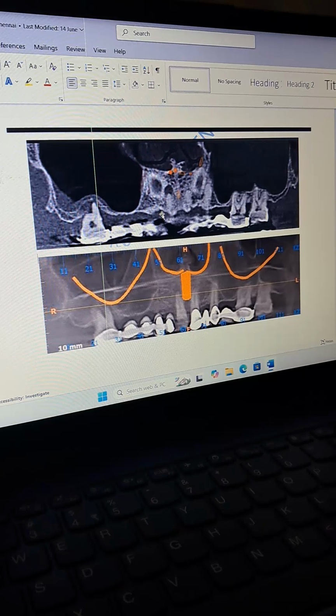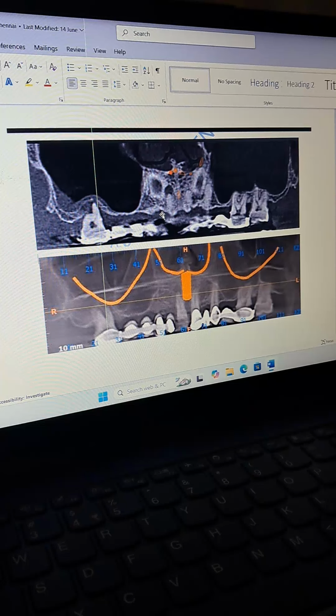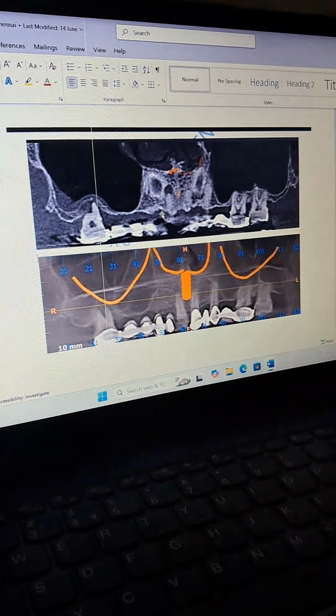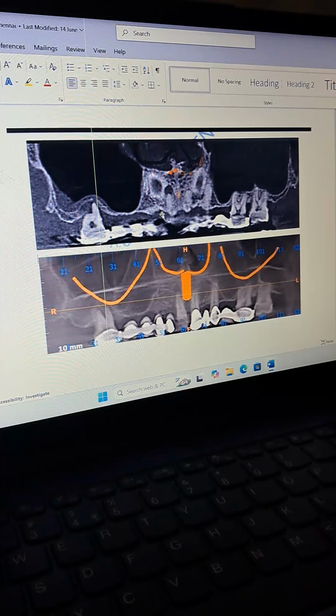If you are using a guide for pterygoid, then you may not miss, but I, per se, do most of my pterygoid implants blind, never using guides. So for me, having this kind of knowledge and picture in front of me is very helpful during my surgeries.